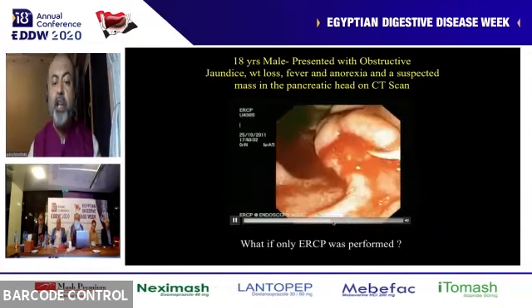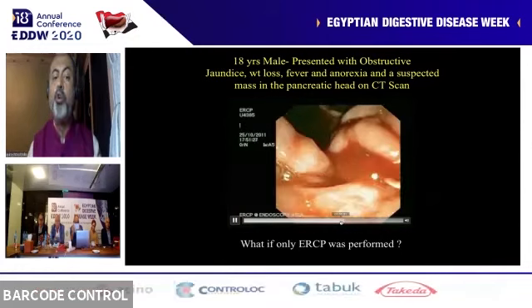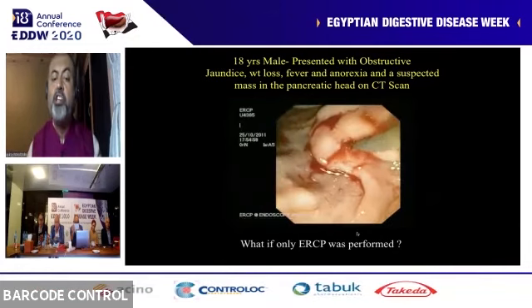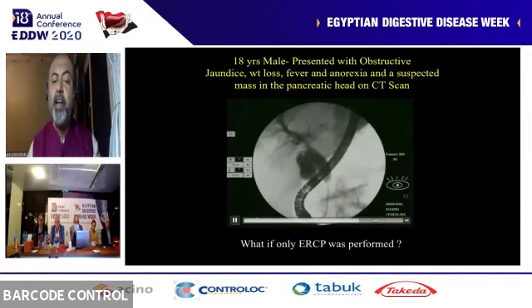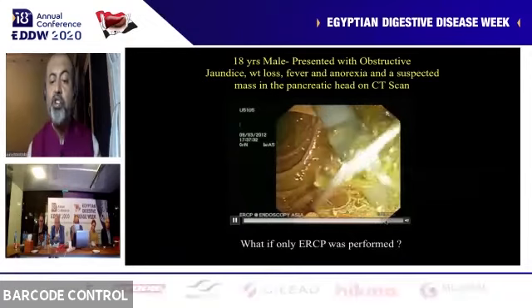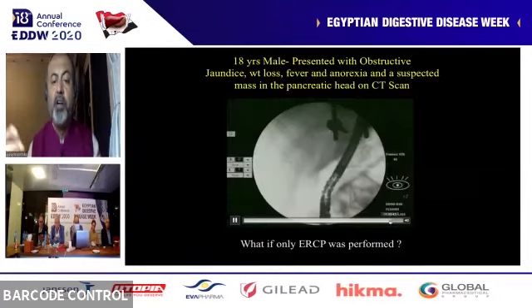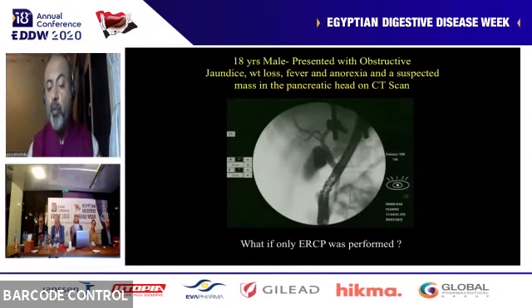So we did biliary sphincterotomy and placed the stent. The brushing was negative, as I can show you here. We did brushing. So what clinched the diagnosis was EUS FNA-B, and then I placed a stent, and then the patient was brought in after 3-4 months, and you'll see that the stricture is completely resolved. And this is the beauty of endosonography when you integrate it with pancreatobiliary interventions.